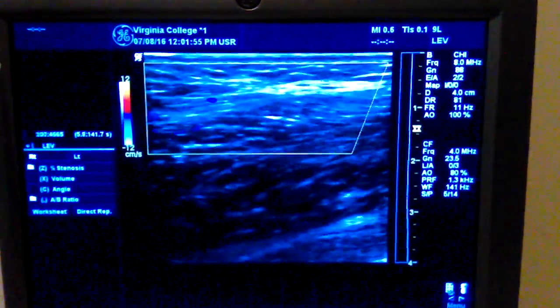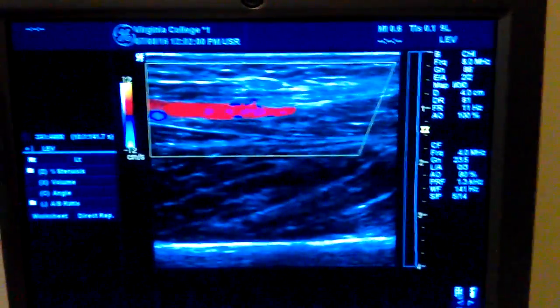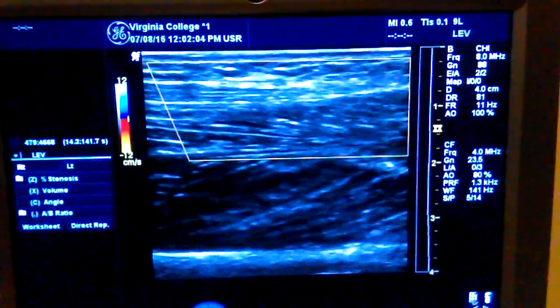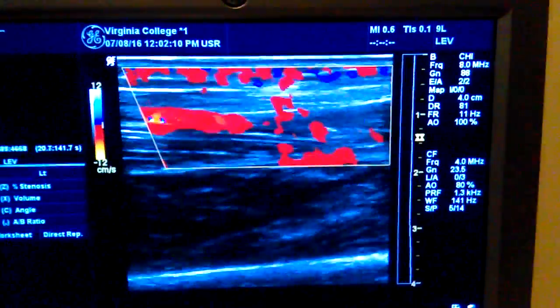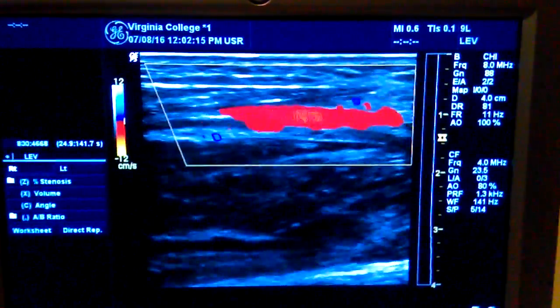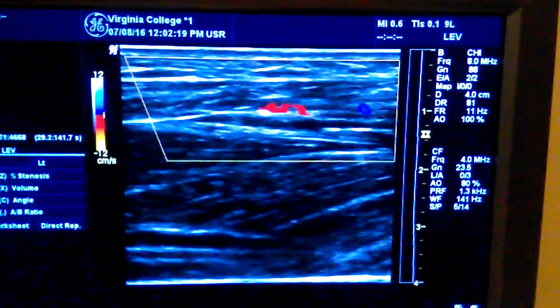Alright, so there we have our artery. Quan's sock is getting in the way. Okay, let's go the other way. I like all my stuff kind of going in the same direction. I hate changing the box back and forth, but it's got these Nikes all in the way. You got to be very easy with your pressure, or you can compress the vein.